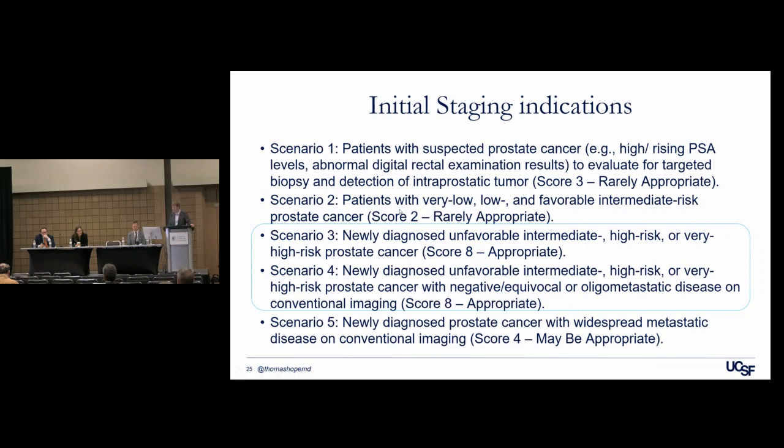And then in patients with very low, lower, favorable intermediate risk, it's not appropriate. All the clinical data to date is in patients who have high risk or intermediate risk prostate cancer. And then looking for patients who don't yet have a pathologic diagnosis, obviously it's not indicated.